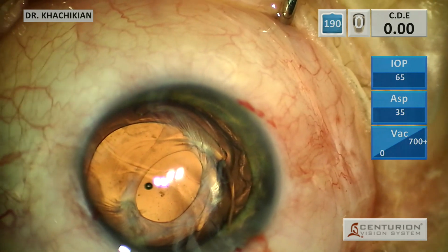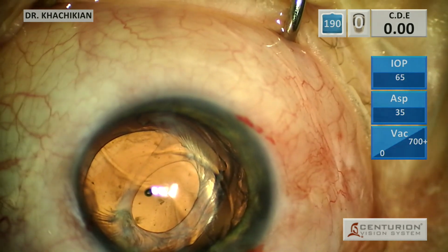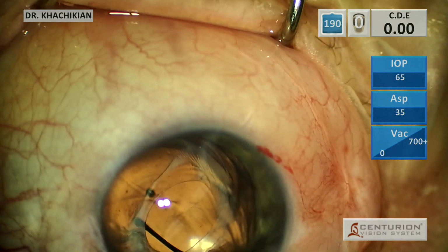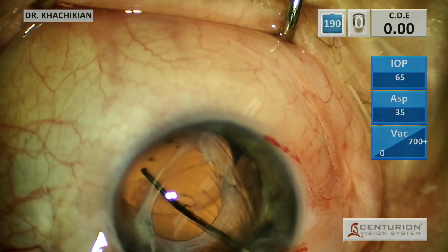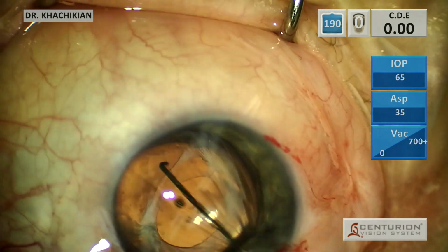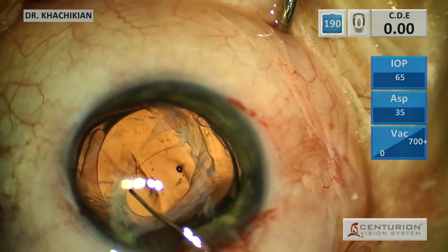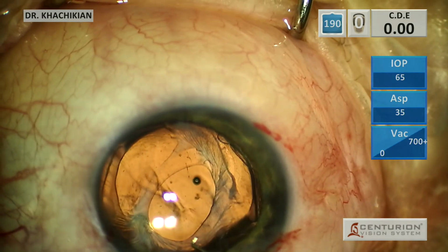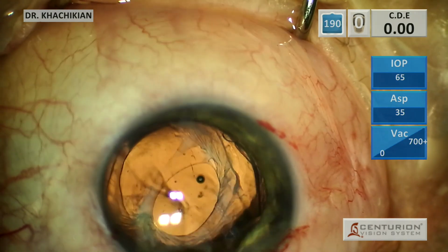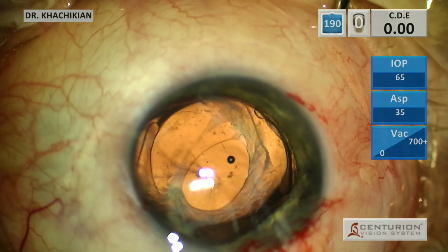And a little more visco. We'll see if we can get this lens to hopefully be freely spinning in the bag is what I'd like to see. Get that inferior haptic freed up. Get it so the superior haptic can expand. There we go. That inferior haptic is now free. So that capsular opening is kind of small, but we may be able to address that later on.